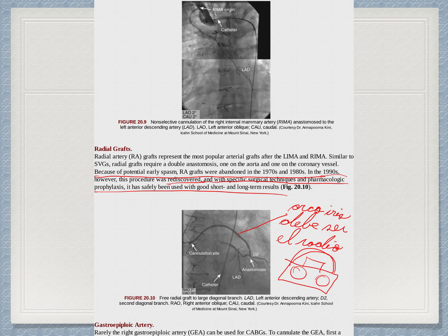Another option is looking at it as radius. So if you have half a circle, you can calculate the radius of a circle. So this graft has a curvature which is like a semiluna or half moon. So you could think that you have enough information to calculate a radius. Whichever works for you, fine. This is for radial grafts. This is what it reminds me in the angiographic projection.